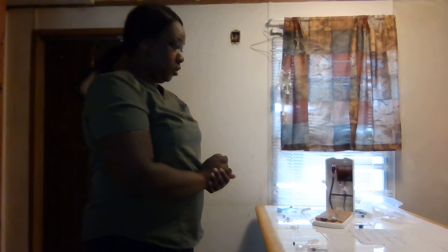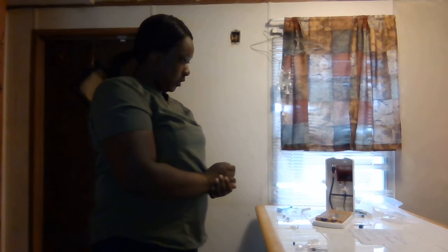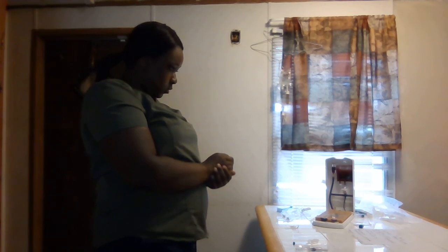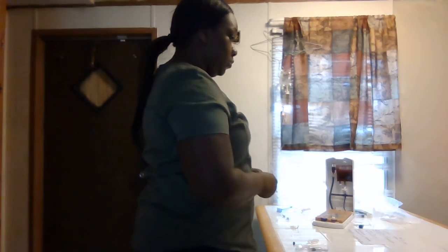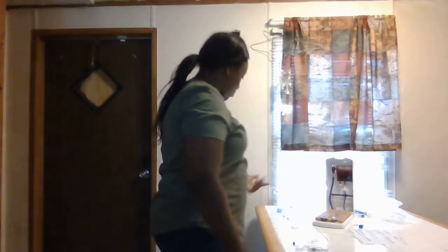So we will clean off the INT port with alcohol, flush it with my normal saline, of course priming the saline. Flush it. I think that's it.